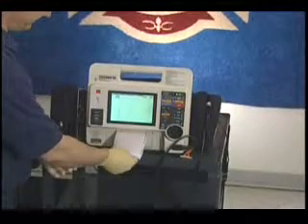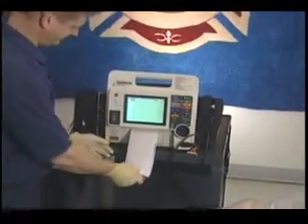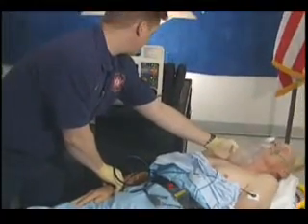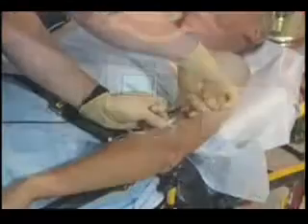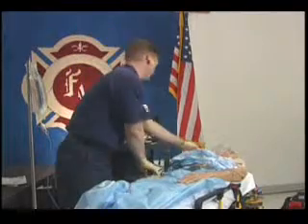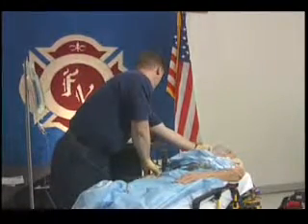Run ECG strips at periodic intervals to document the ECG rhythm. Assess the patient for his or her response to the paced rhythm. Measure pulse and blood pressure in the right arm and ask the patient about pain. Administer an additional sedative as needed to maintain patient comfort. Avoid unnecessary patient movement after pacing is initiated. Continuously monitor the patient en route to the hospital.